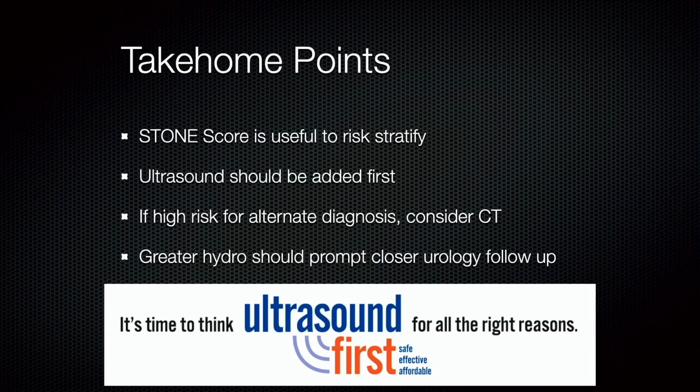of renal stones. The next take-home point is add ultrasound first, right? It's a low-cost, low radiation or no radiation modality that you can do to evaluate the patient. And in the right context, you can get that specificity high enough and the risk of alternate diagnosis down low enough that certain patients you may be able to stop there, right? Even if you don't see a stone.